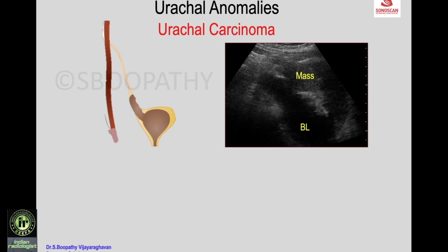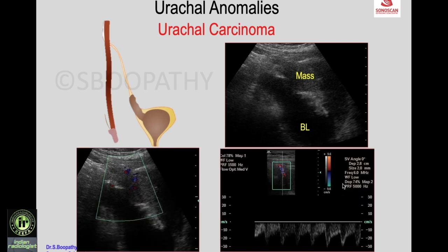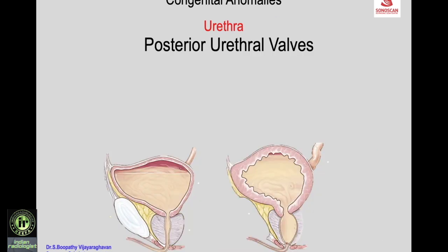Urachal carcinoma can bulge into the bladder: an irregular pyramidal mass protrudes into the bladder from the dome with an irregular mass in the wall. Color Doppler shows flow within it with a low-resistance flow pattern, confirming urachal carcinoma with extension into the lumen of the bladder.